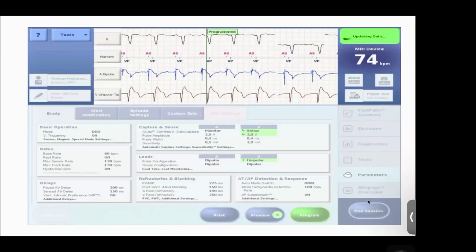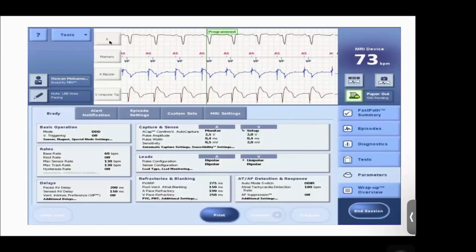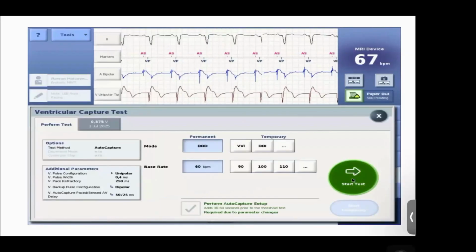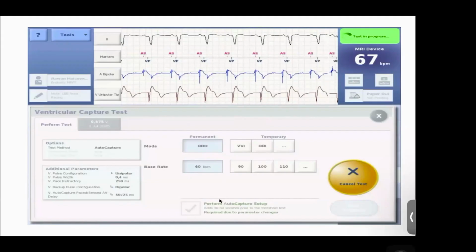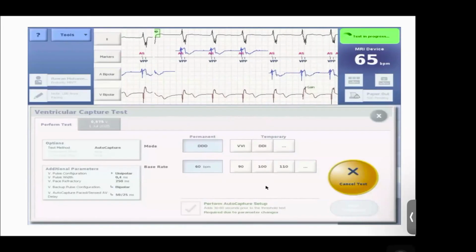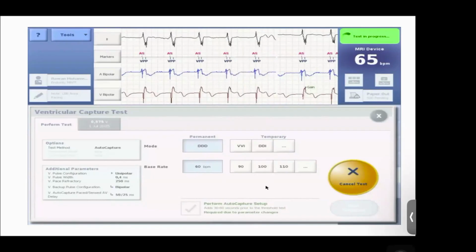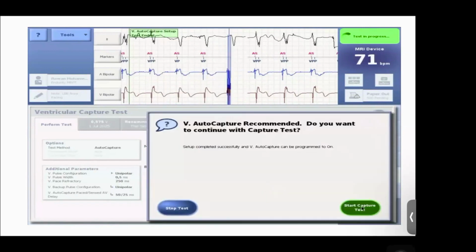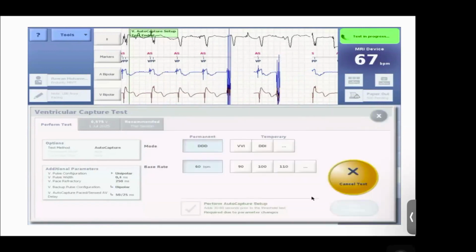And there is an R wave, small r in lead 1, as you see, but we cannot judge on this surface ECG connected to the programmer. Our judgment will be mainly on the ECG. But here also you saw that the QRS complex, even in the ECG connected to the programmer, is different during pacing.